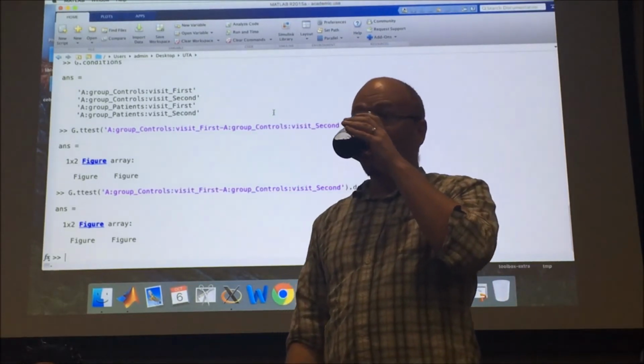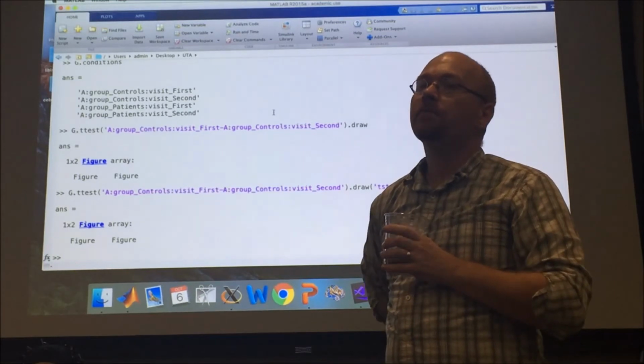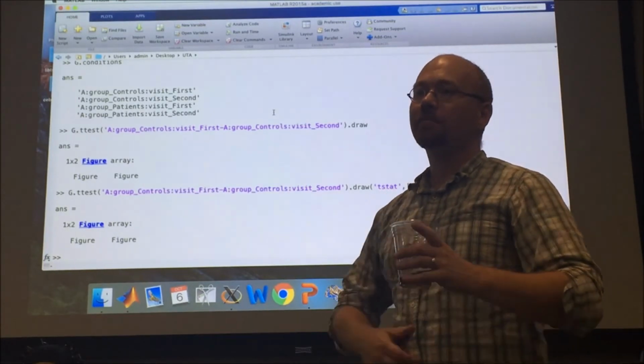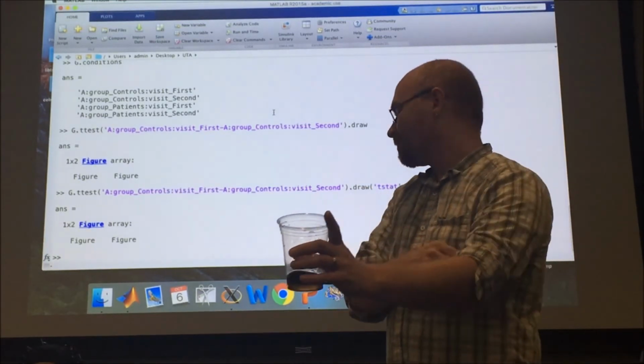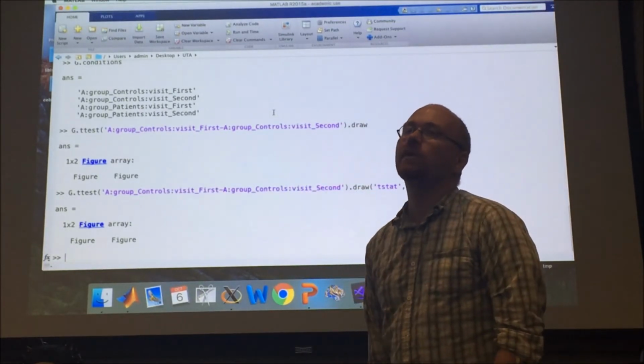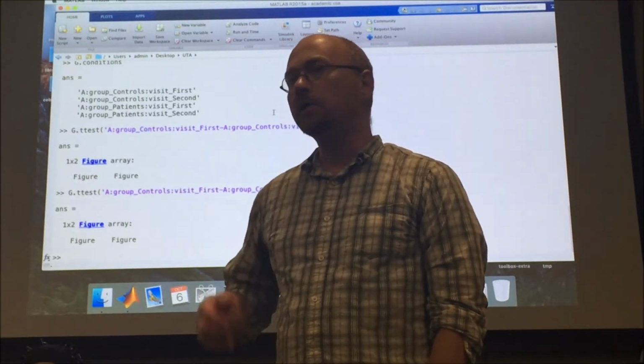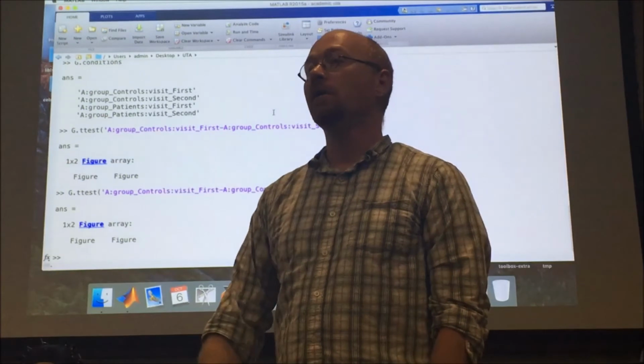This probably is very basic for those who do this, but I'm at a bit of a loss as to how you're doing this, averaging and co-registering people without anatomy. So is it comparing probe 1 to probe 1 on everyone? How does it guarantee that you're all hitting the same place? There's the problem of registration across subjects.